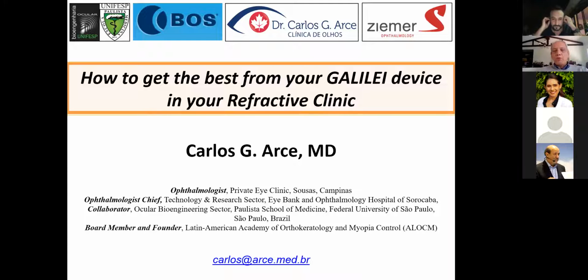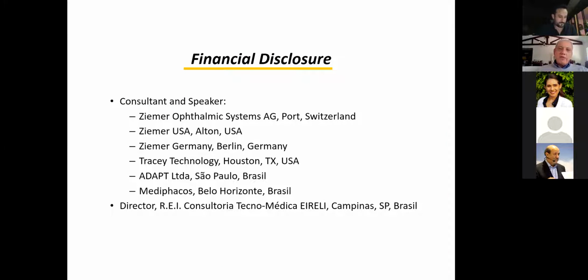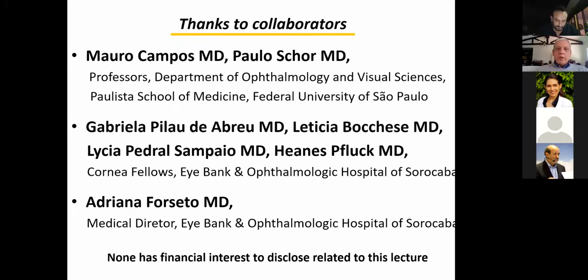Today, we are going to see something about the Galilei, my financial disclosures, and I want to thank the collaborators during all these years working at the Federal University of Sao Paulo, the Sorocaba Hospital, and iBank.